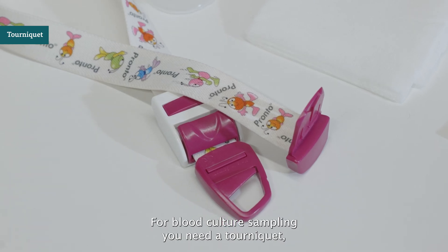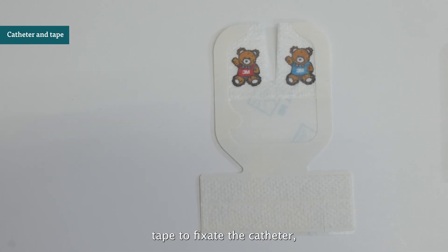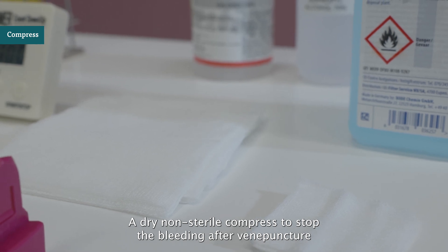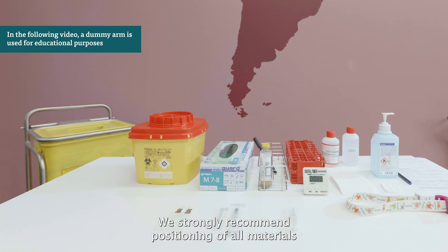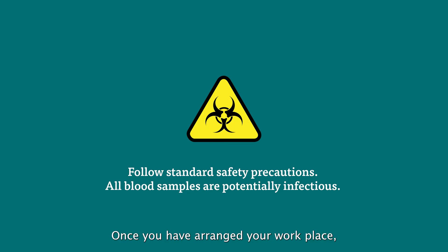For blood culture sampling, you need a tourniquet, an IV catheter and its lock, tape to fixate the catheter, a sterile 2 ml syringe, and a 23-gauge needle. Finally, you need a rack for blood culture bottles and a rack to hold a syringe, a dry non-sterile compress to stop the bleeding after venipuncture, a sharps container, and a biohazard container. We strongly recommend positioning all materials at the side of the dominant hand to avoid crossover of the arms during the procedure. Once you have arranged your workplace, you can start the procedure.